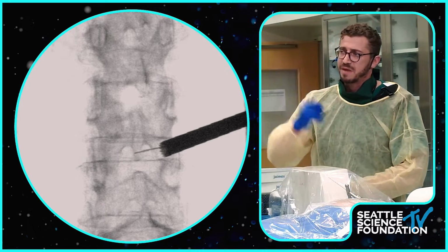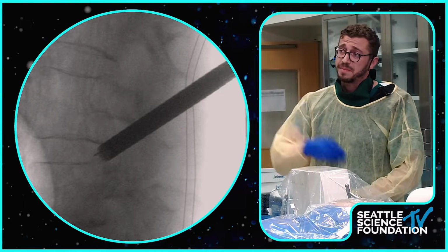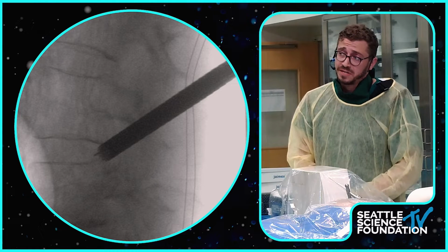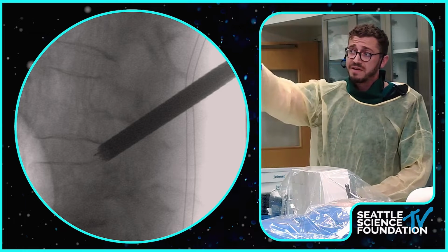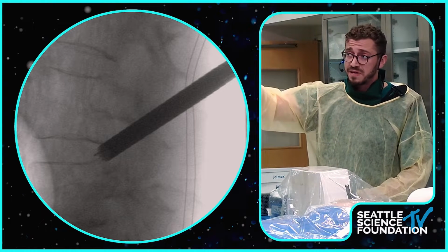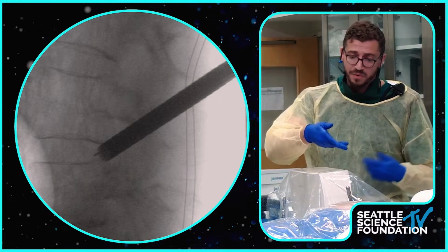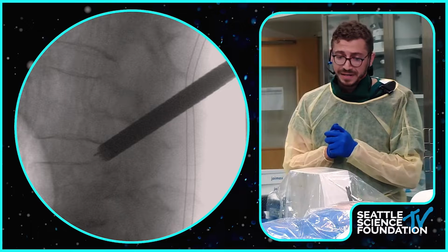But I felt the disc and I popped through the disc for sure. I try not to do that in real life. So actually here it's mostly in the epidural space. Not much of it is in the disc space, which is great. And that's a great final position. You know, you're at the PLL there. On the AP, that's exactly where you want to be. On the lateral, that's exactly where you want to be. And then now you really put your working channel in there.